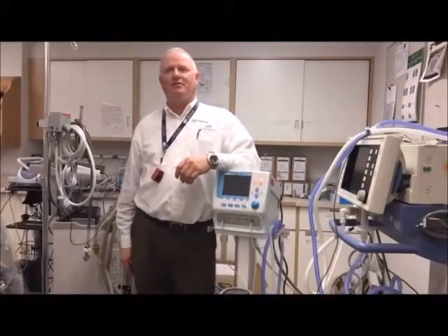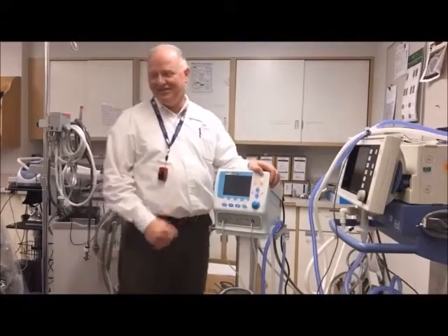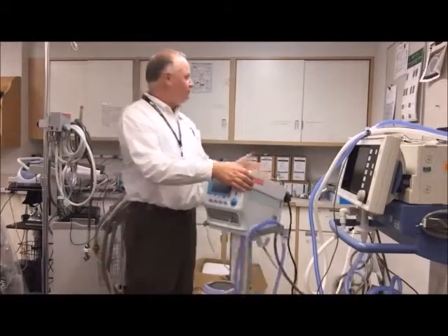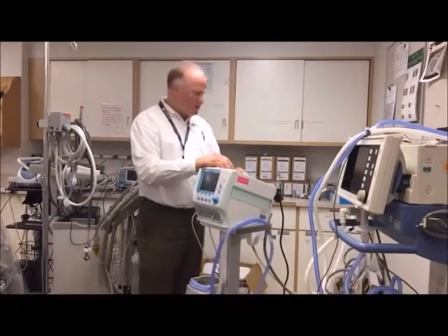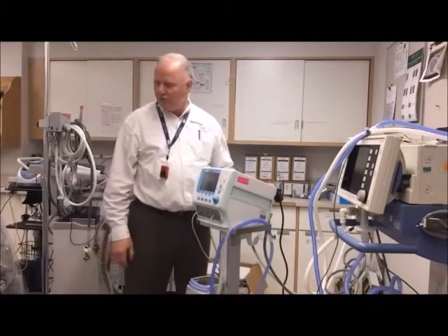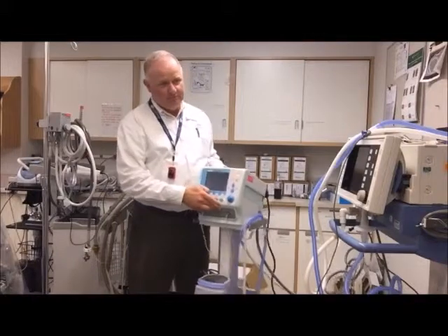This is a Fabian therapy ventilator. Pretty simple — oxygen comes in here, electricity there. There's no power switch in the back; you just turn it on by pushing the green button.